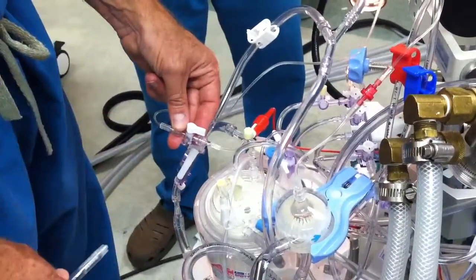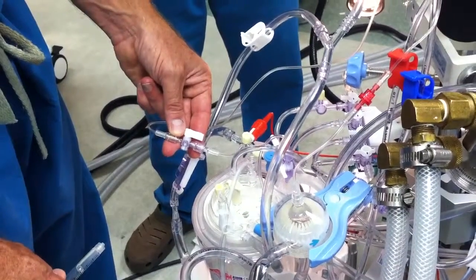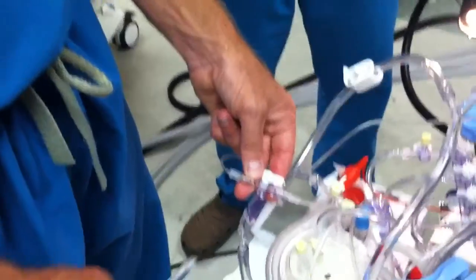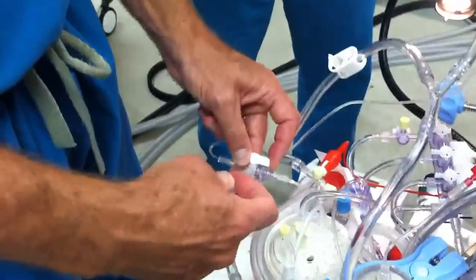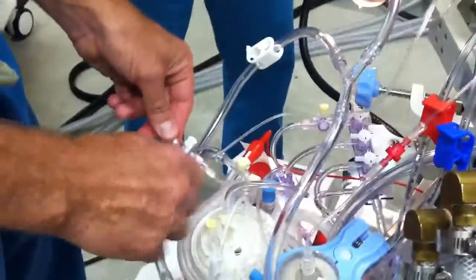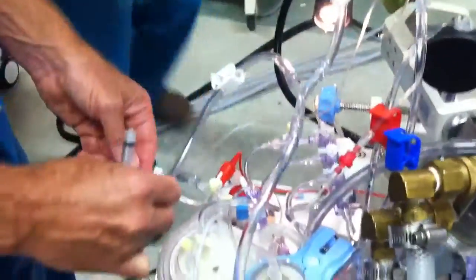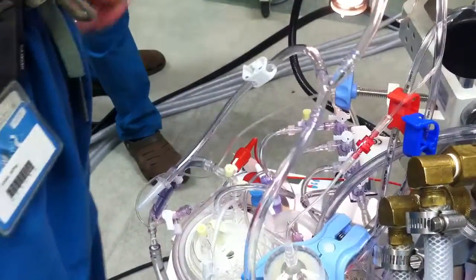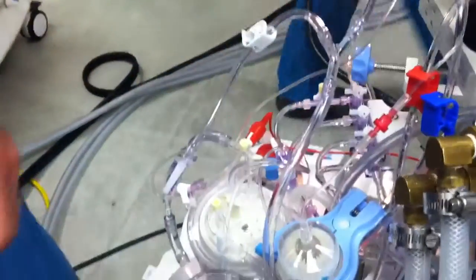Now if we undo it — see, it's flowing like a banshee. It's flowing like crazy. Look at that, it's flowing just like a banshee. Exactly like a banshee. Definitely flowing. Yes, flowing. So we're good. That's good. Use it.